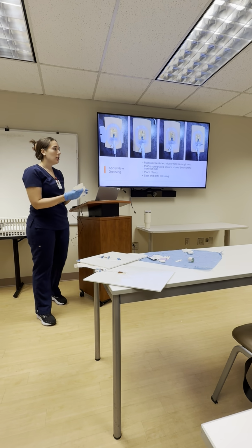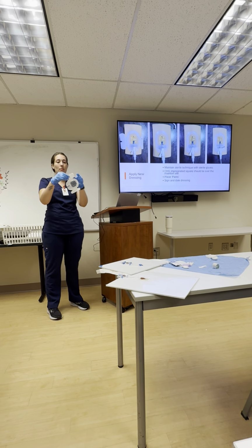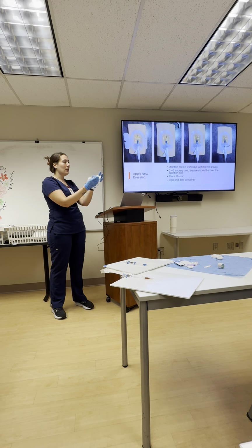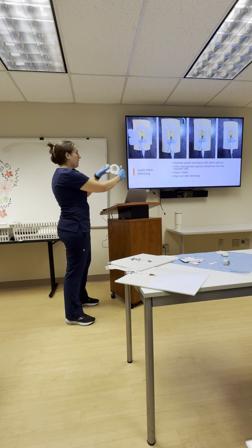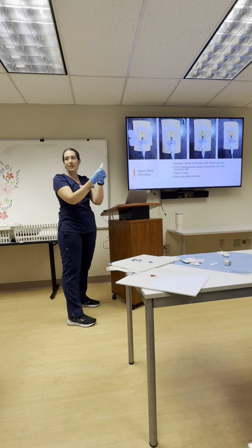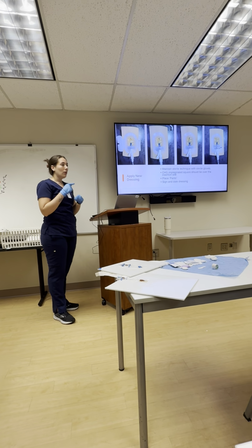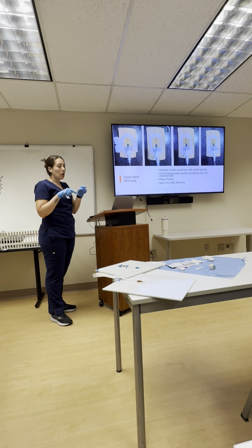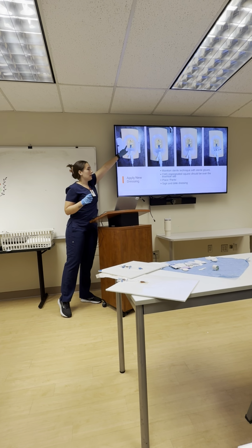Okay, once we do that, you're going to take your CHG dressing and you're going to peel back the bottom, sorry, like that. And I like to hold it once I peel it back like this, just because sometimes with the sterile gloves and the stickiness, it kind of gets caught up in that. You want to make sure that little square that's kind of orangey yellow, that's a CHG impregnated square, is on top of the insertion site.